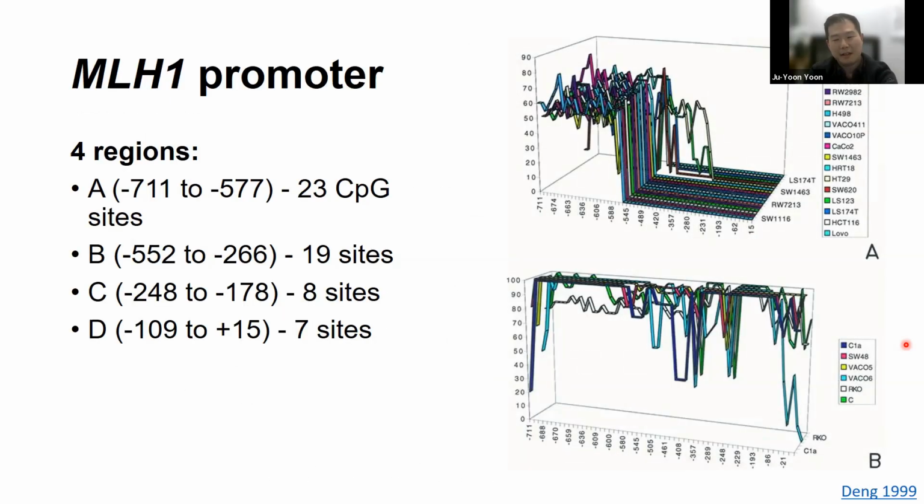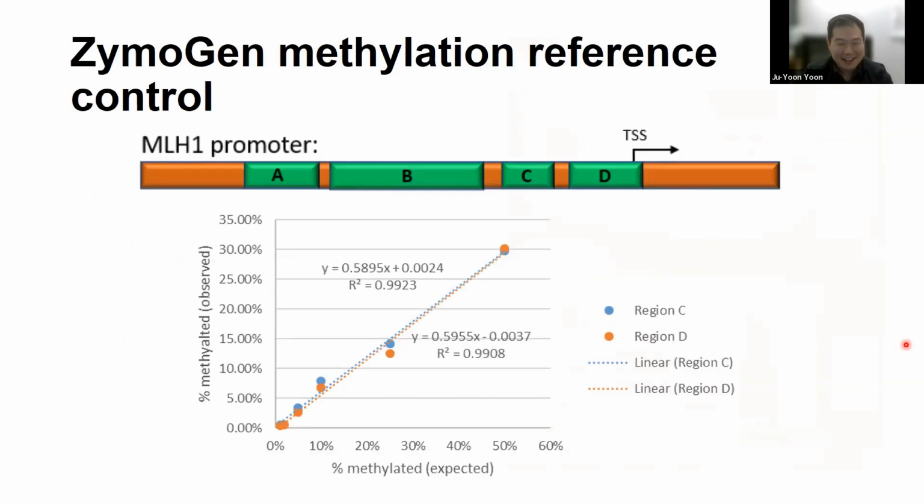Really? Okay. My understanding was C, but it also doesn't help that they're out of order on the MRC Holland kit. A is third, so I always thought of it as number 3, and then reading the product insert, you realize that no, that's actually the farthest away, even though they order it by probe length, so it's kind of confusing. There are nitty-gritty things like that. Anyway, good assay though. Good assay. Thank you. Clearly, everybody thinks so.